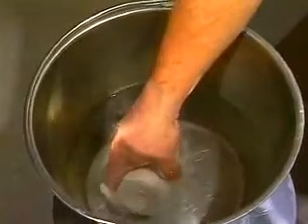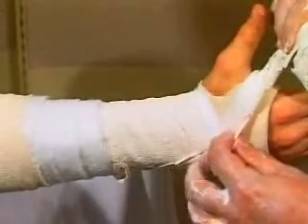Hold the end of the plaster roll and soak in room temperature water. Squeeze out excess water. Start wrapping the plaster distally, keeping the roll close to the limb to avoid excessive slack or tightness in the cast. Plaster can be pinched through the first webspace.